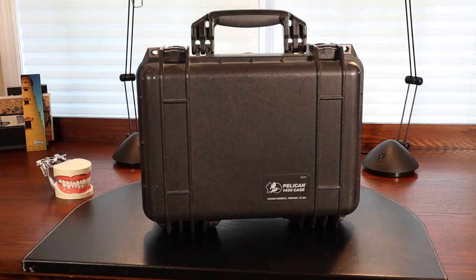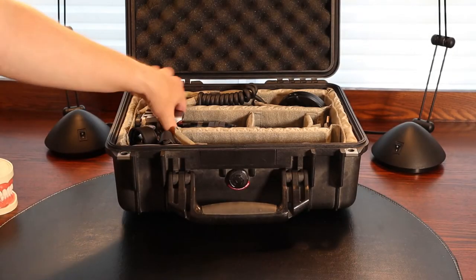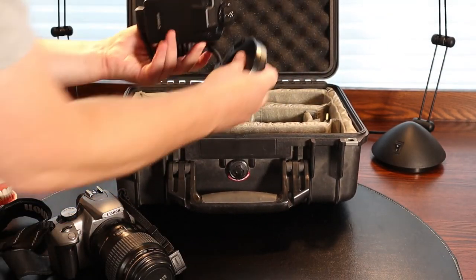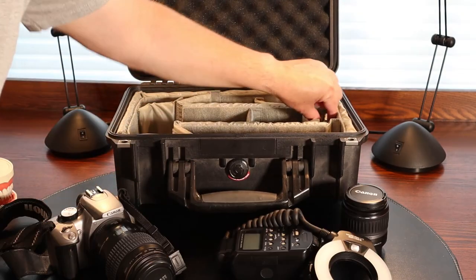The kit came in a hard-sided Pelican 1450 case — it's a waterproof case with foam padding inside. My case came with Velcro-secured padding that can be arranged to fit your equipment. Mine was set up to fit my camera with the macro lens mounted, as well as separate spots for the kit lens, the ring flash, and room for the charger, compact flash card reader, and extra compact flash cards.